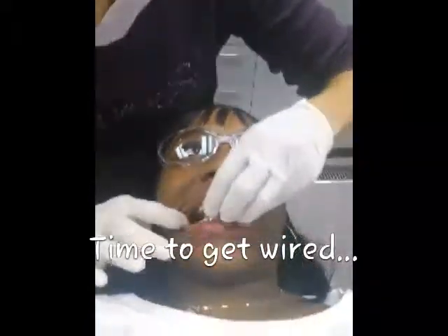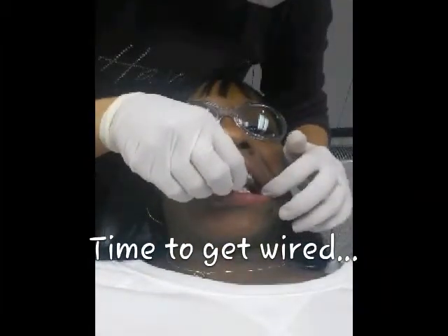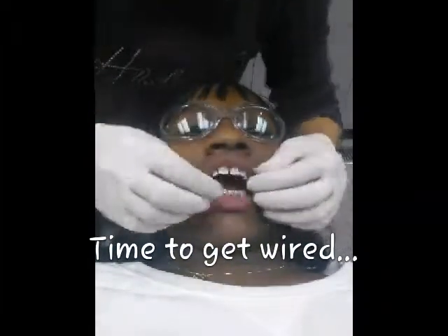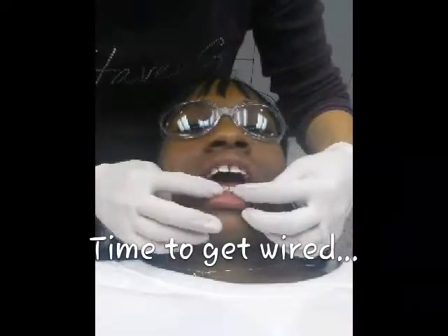And so she moves on to the bottom set of teeth and puts the wire on the bottom. And she does the same thing. Places the pearl rubber bands around each bracket and snips the wire.